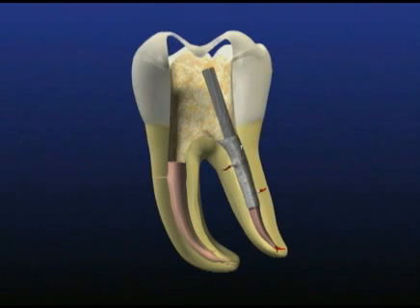Once we have obtained complete straight line access, the Pro Ultra Endo 1 is activated and moved around the post circumferentially and up and down along its exposed length. Experience suggests most posts can be safely removed in approximately 10 minutes. This is my 10-minute rule.